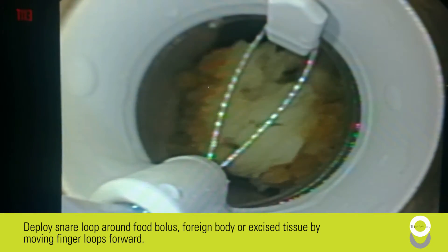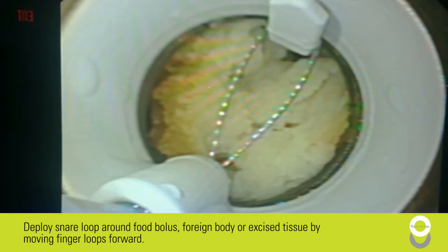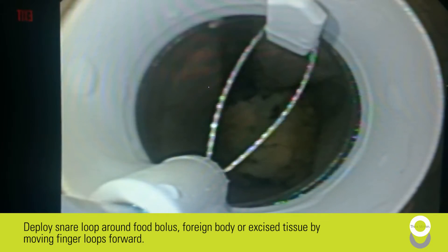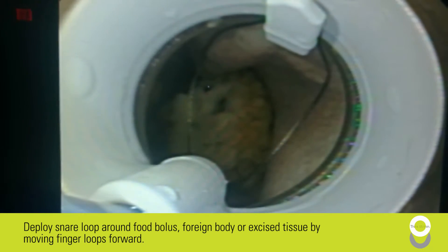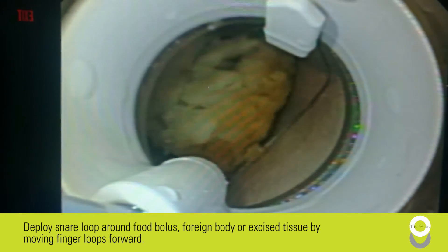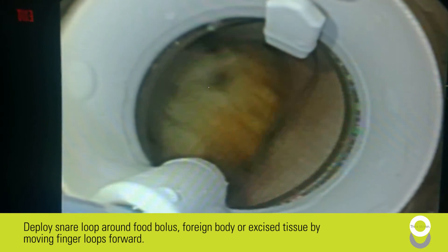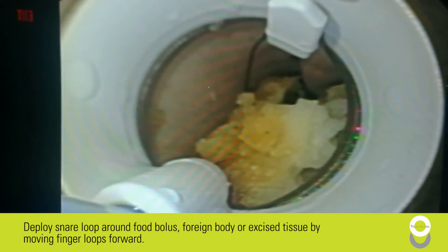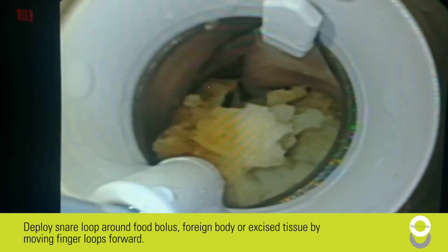Deploy the snare loop around the food bolus, foreign body, or excised tissue by moving finger loops forward. During retrieval, allow for proper spacing between the end of the eSuction cap and the object being retrieved before deploying the snare. Deploying the snare too closely to an object may result in the snare detaching from the anchor side of the eSuction cap.